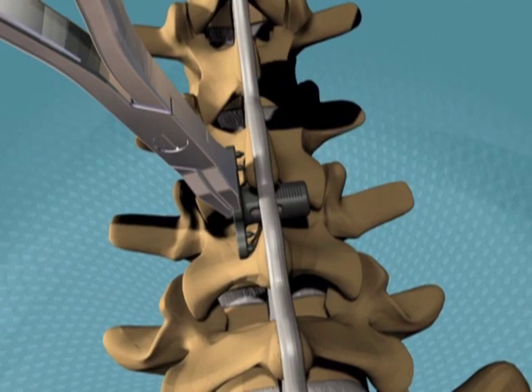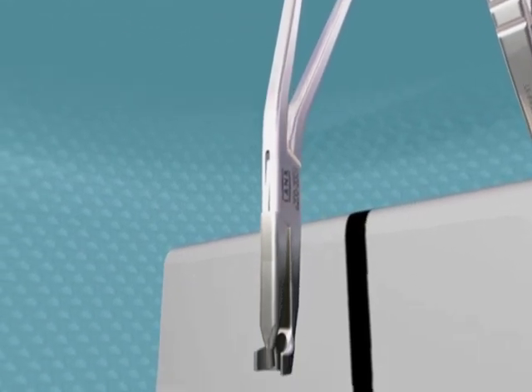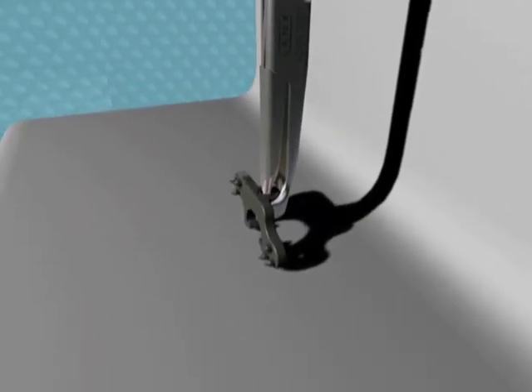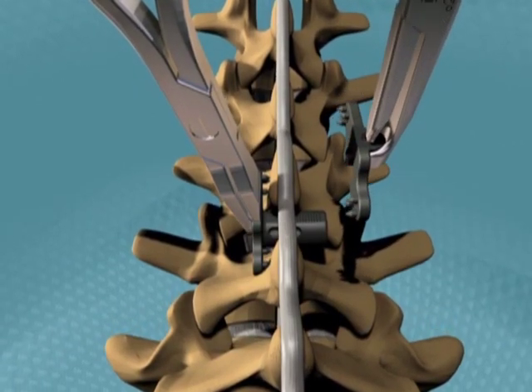Attach the mating lock plate to the lock plate inserter. The peg side of the inserter fits inside the set screw, while the curved portion surrounds the set screw housing. It is important to ensure that the set screw has been slightly backed up to allow the plates to slide together.